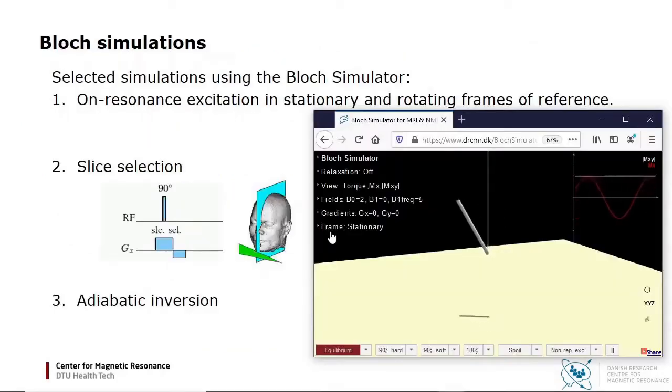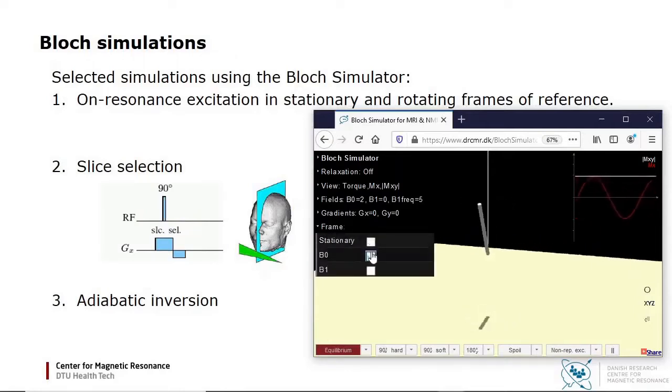Here you see precession once again. Let's change to a frame of reference rotating at the Larmor frequency. You still see the precession, but from a different point of view. This is reflected in the rotation of the floor. In this rotating frame of reference, the magnetization is now stationary, so the B0 field appears to be transformed away.